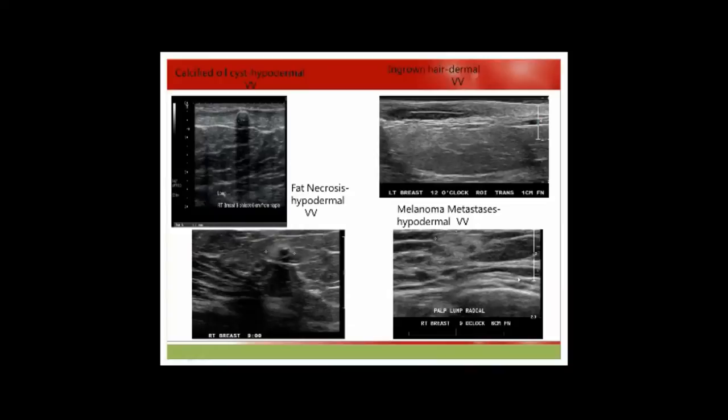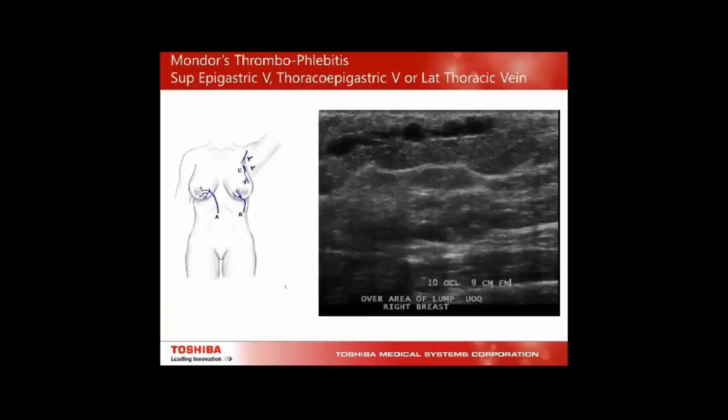Within the breast hypodermal layer, we can see calcified oil cysts, ingrown hair within the areola region, and fat necrosis. However, one case showed fat necrosis extending through the layers — this was actually a melanoma metastasis. It felt firmer than fat necrosis and the lady had a history of melanoma.